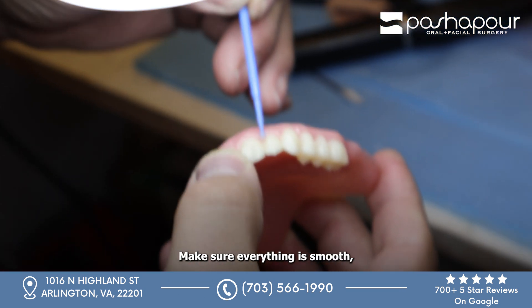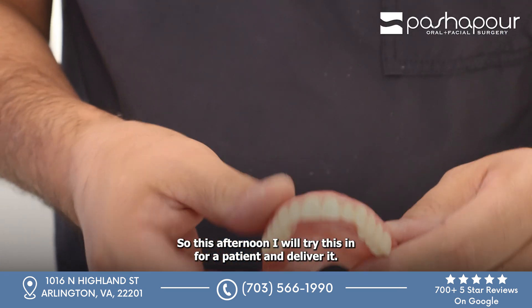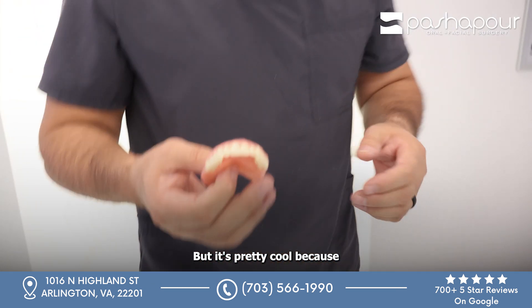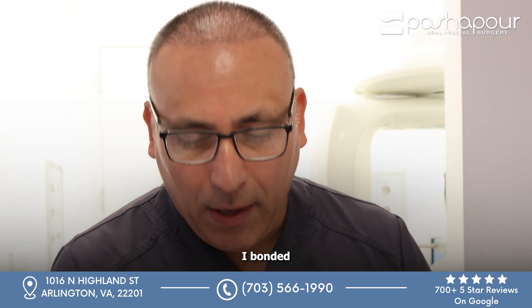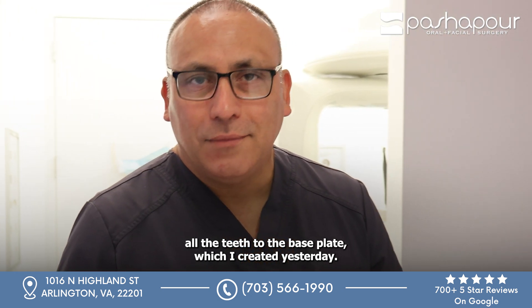I'm going to polish the teeth up really nice, make sure everything is smooth. So this afternoon I will try this in for a patient and deliver it. This is a temporary denture, but it's pretty cool because I did this in one day — it took me less than 30 minutes to put it together. I bonded all the teeth to the base plate which I created yesterday.